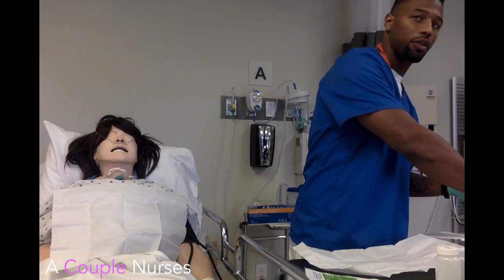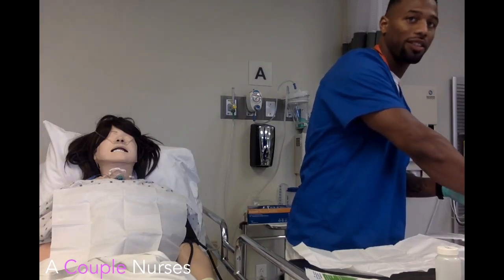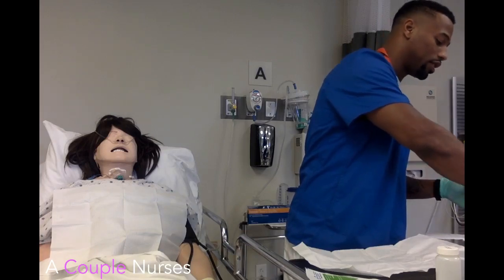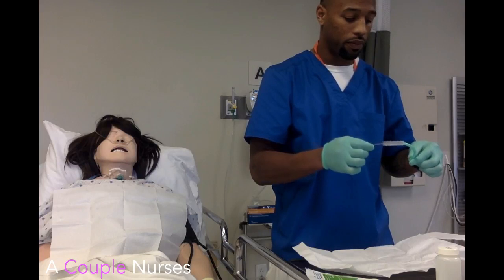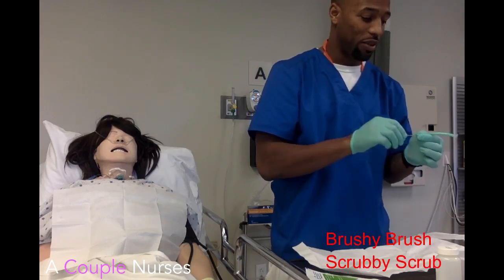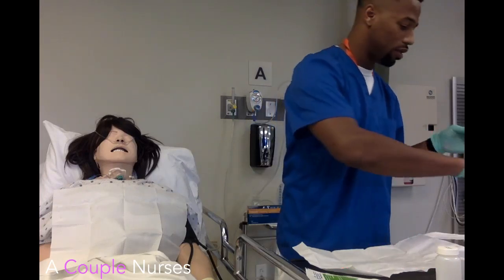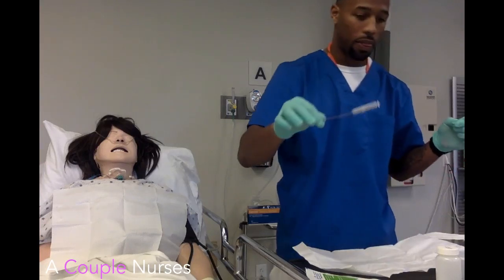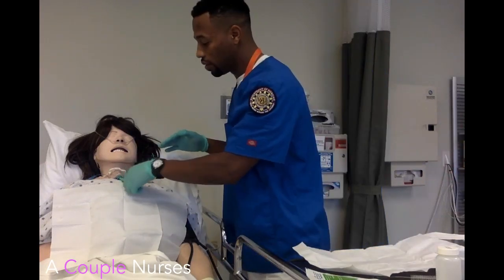You know if this is hydrogen peroxide? Sterile hydrogen peroxide. I rotate to clean all the gunk out of it. Everything is now dirty.